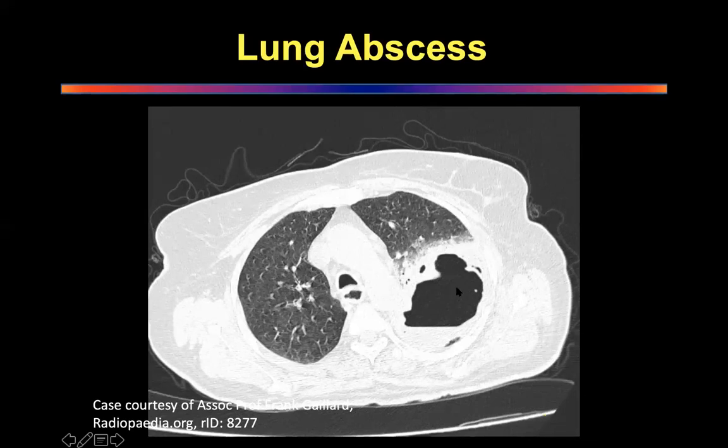The other thing which I would comment on is that the quality of the lung doesn't look good. It seems to have some bronchiectasis or some changes happening in both the lungs. Yes, sir. All right. Well done. What do you want as the next investigation for this guy?